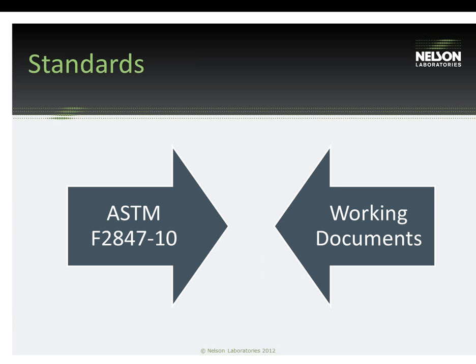It's important to note with this standard that we are really just focusing on surface residue contamination here and not any leachables. And so that's an important note with these cleaning validations. There are also two working documents in place that we wanted to mention that the ASTM has out that have to do with these cleaning validations as well. The first is a working document for designing devices for cleanability. And this is a trend we're seeing where manufacturers are starting to think of the cleaning validation up front when they're designing the device as well as the overall process.